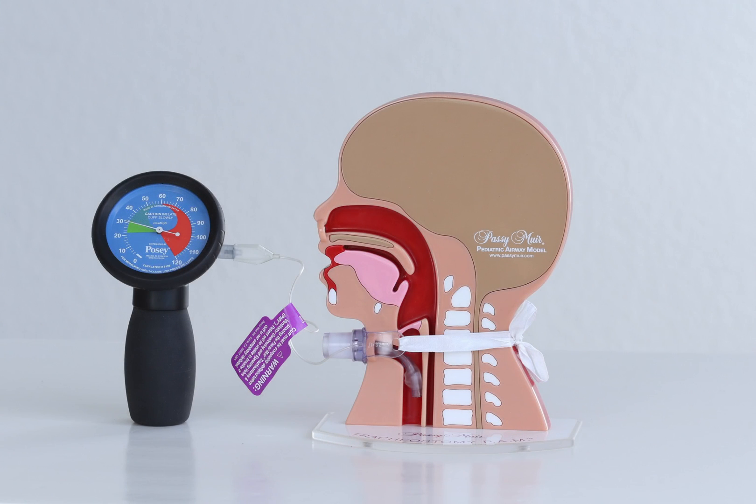Cuff pressure measurement. Cuff inflation should be done slowly to avoid overinflation and can be monitored by measuring cuff pressure. Simply palpating the pilot balloon is not an appropriate way to assess cuff inflation and may cause harm.